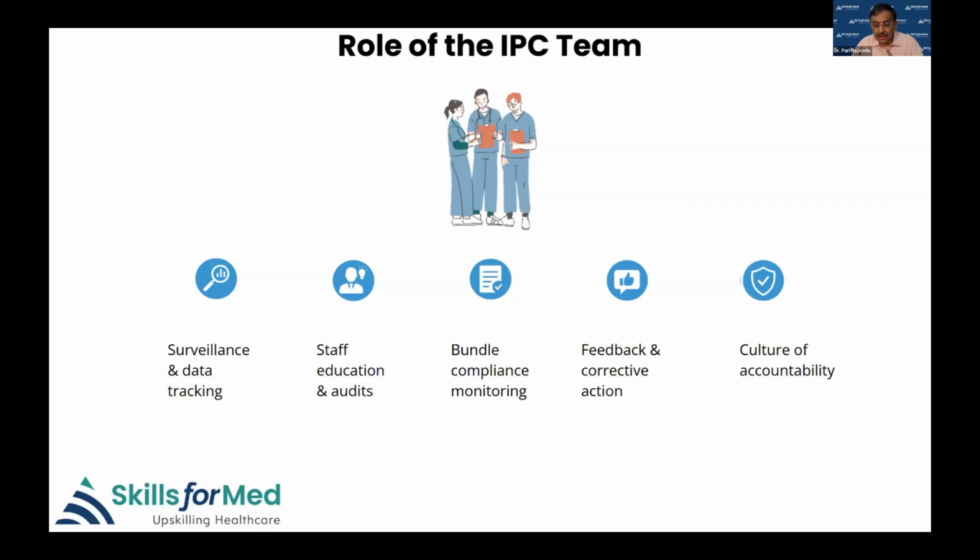As you will see, if you read the Pronovost paper, it is open access. You can Google for Peter Pronovost CLABSI. You will get the paper. You will see that education was a major part of his success. For each and every new hospital he onboarded for this project, they went through a methodical process of telling them why those 5 steps were necessary and educating them on these things. So staff education is necessary.